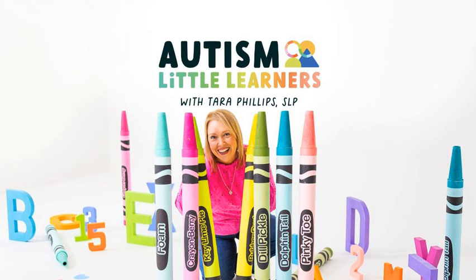Now, I want to give a few tips for success when it comes to AAC devices. Embedding AAC into daily routines takes intention, but it doesn't have to feel overwhelming. So here's a few practical ways to make it work. First of all, keep the device accessible, making sure AAC devices are charged, present, and available all day. That's the key, right? We can't model if we don't have the devices available.